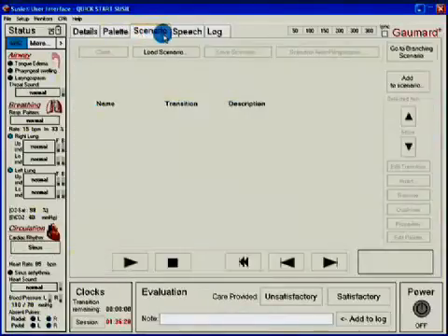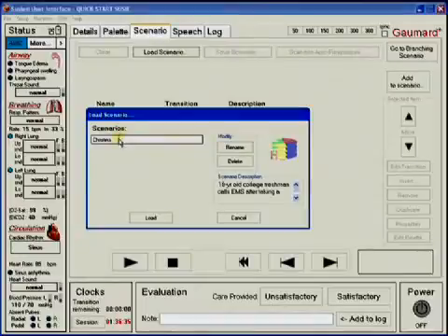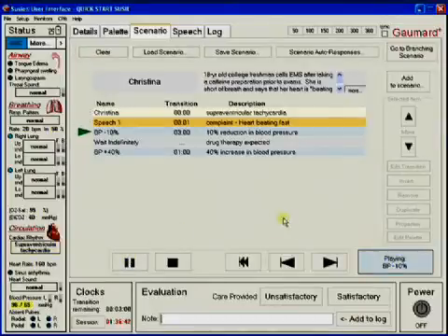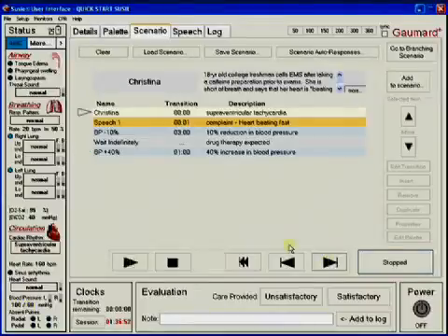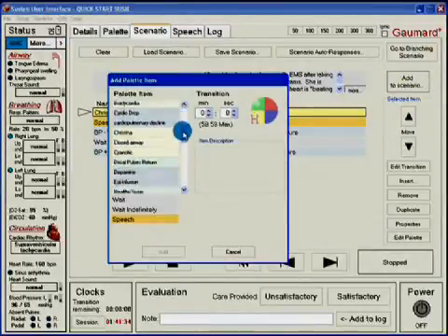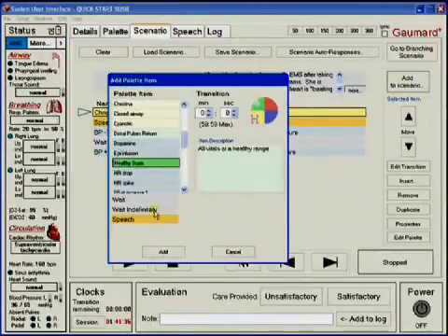For simulations to be most realistic, it is beneficial to use scenario-based training sessions. For convenience, the software comes preloaded with several scenarios to get you started. With SUSI, there are two types of scenarios that can be programmed. The normal scenario is a collection of palette items that play sequentially over a set period of time, and is the most straightforward of the two scenario types. The selected palette items are easily manipulated to adjust the flow and timing of the scenario presentation.